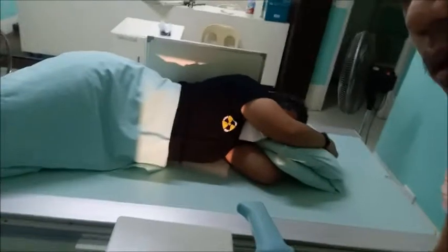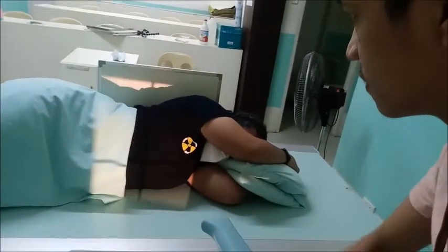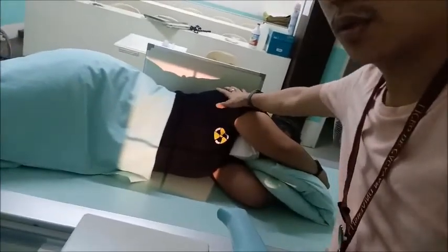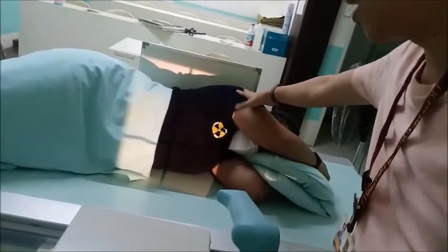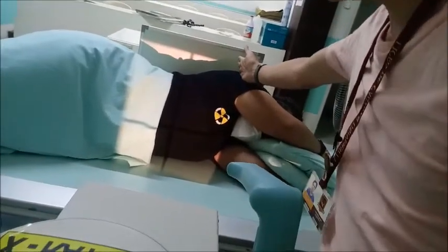Okay. Collimate to the structures of interest, in which the target is the thoracic area of the patient. So include the superior portion and also the inferior portion, which can be collimated.